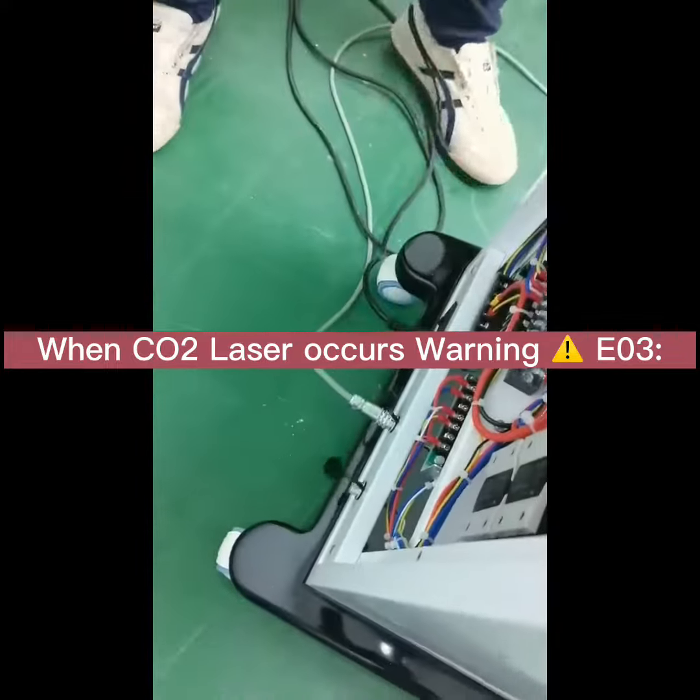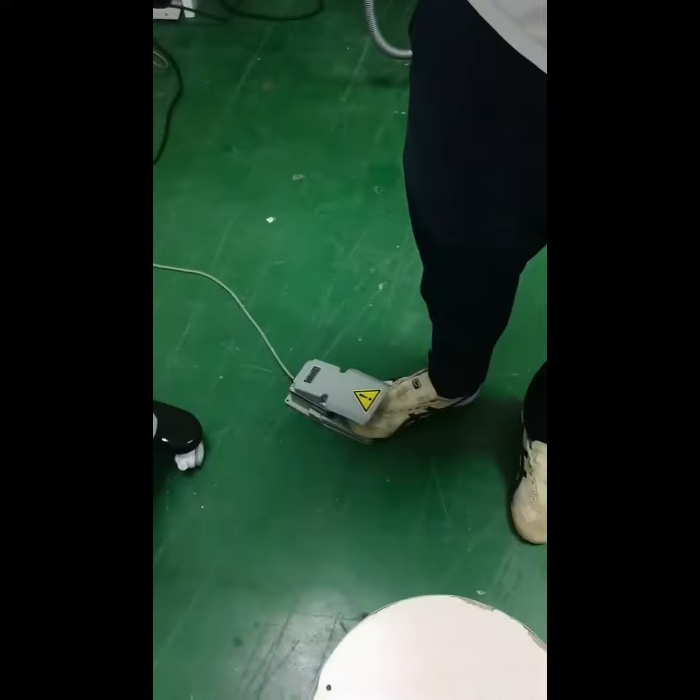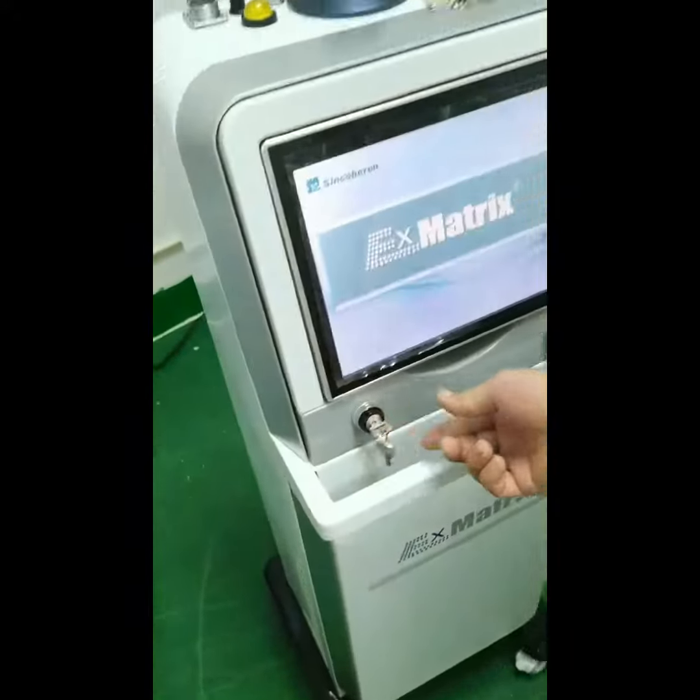Take off the door chain interlock, then step on the foot pedal and turn on the machine.